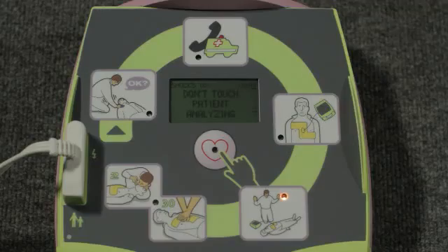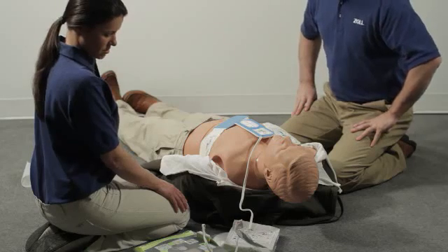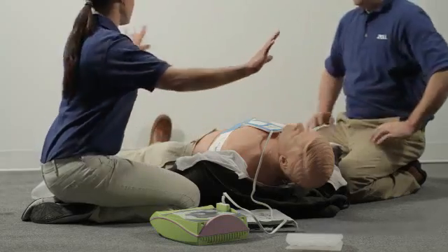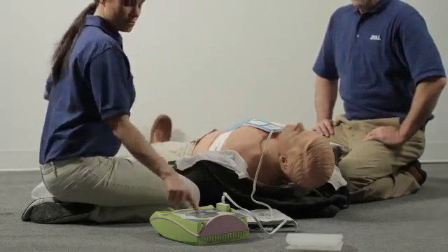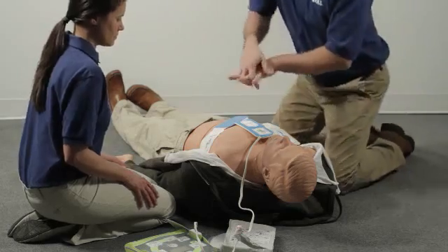Don't touch patient. Analyze. Don't touch the person while the AED is analyzing the heart. Shock advised. If a shock is needed, be sure that no one is touching the person. Press the flashing shock button. Everyone clear? Shock delivered. Start CPR. Immediately put your hands on the CPR landmark.